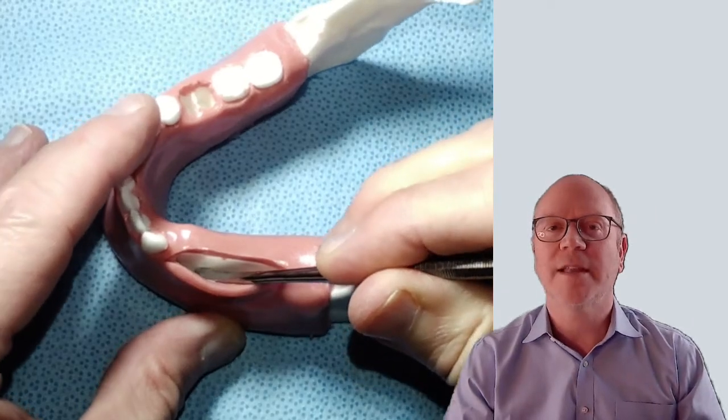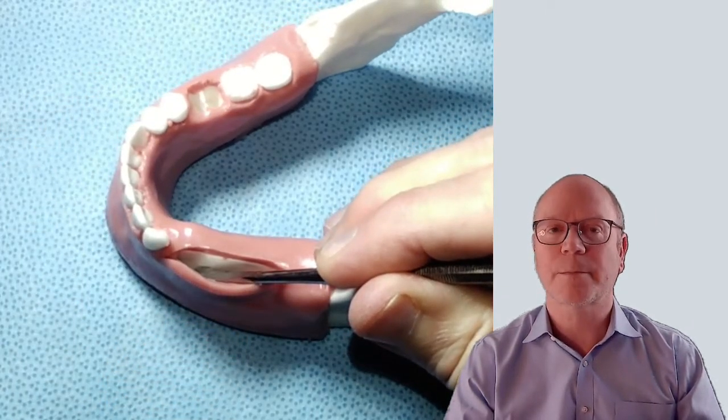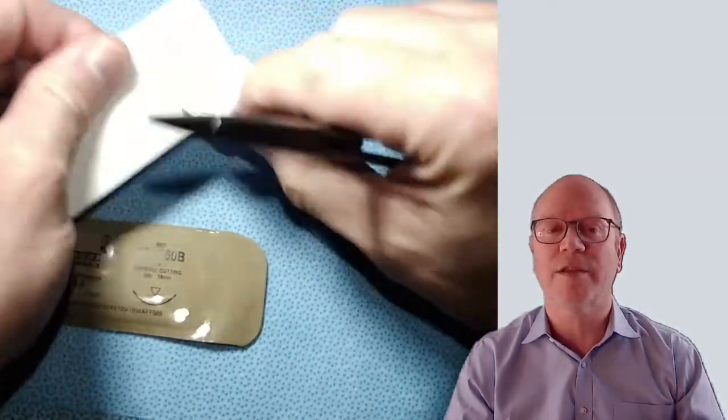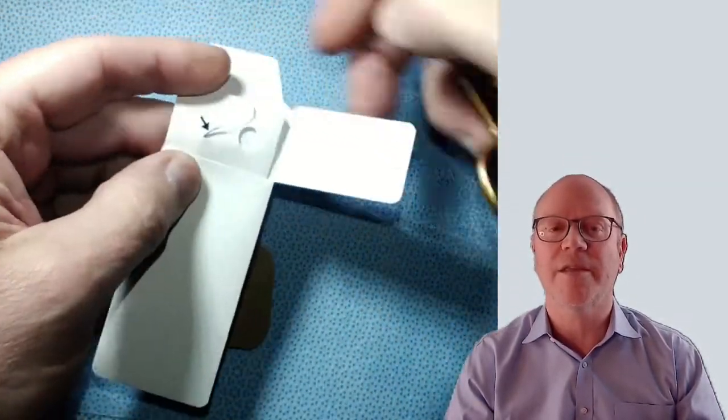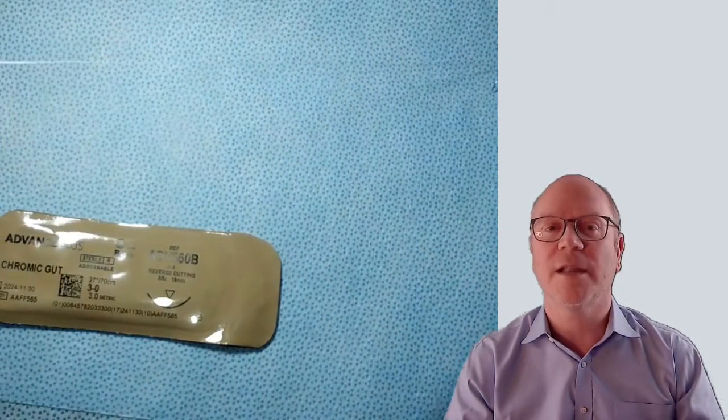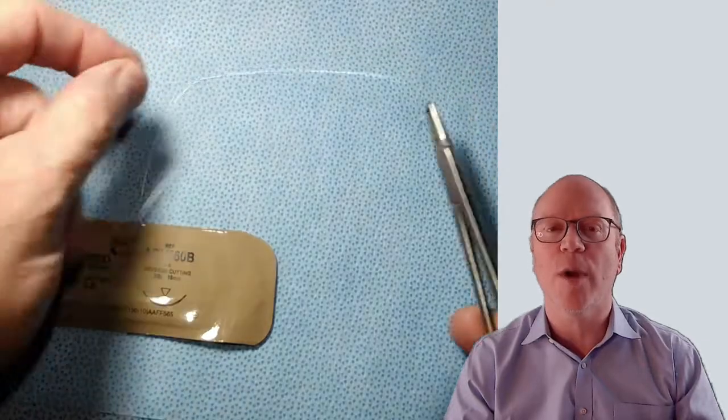Now let's look at those sutures. First, the cytoplast suture — this is a 3-0 cytoplast suture from the same company that makes OsteoShield 4DS. When you lay it down, you'll see it has no memory; it just lays flat, which makes it really perfect to place.